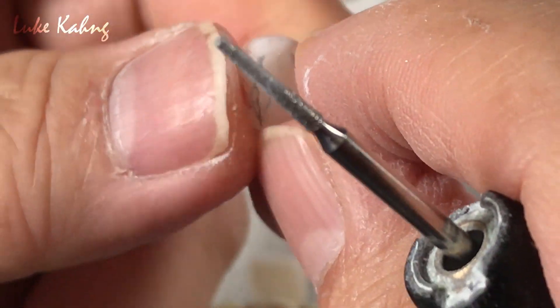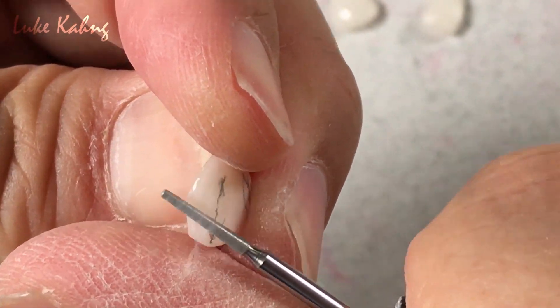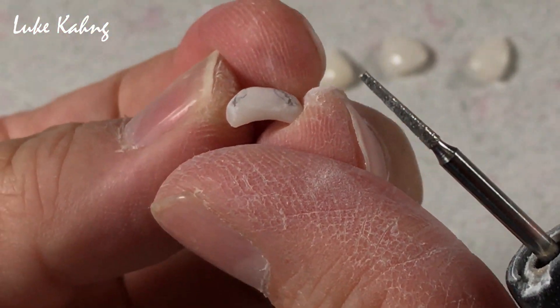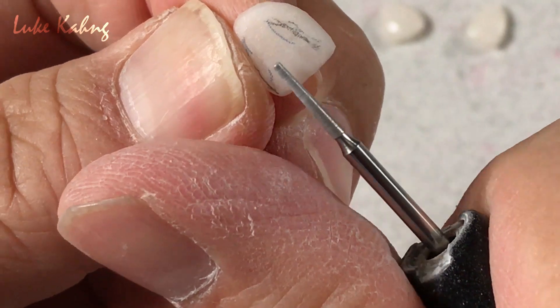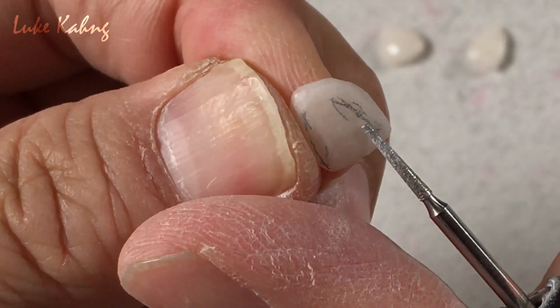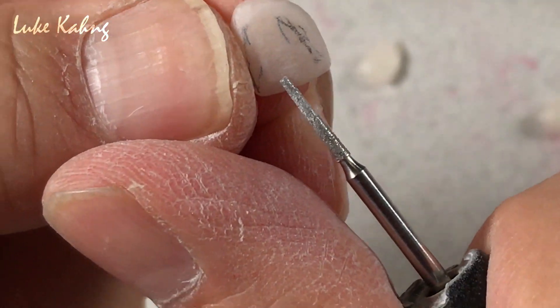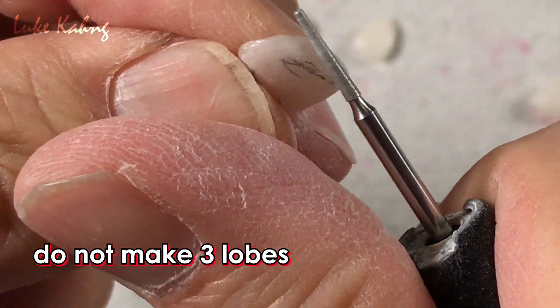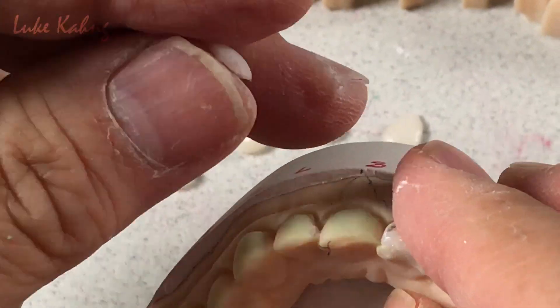Okay, same as here. It is more rounded. And then I can make the little contour here, trying to make two lobes. But do not make two lobes — it will look more small compared to three lobes. So, same as this.